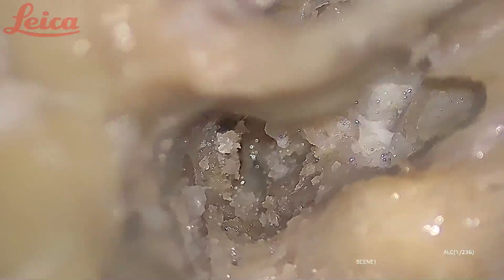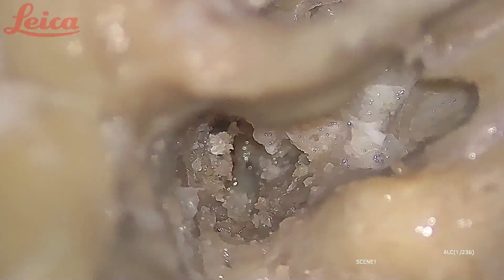What you are seeing now is the GSPN — the greater superficial petrosal nerve. I will show you the soft structure here; this is exposing the area of the GSPN, the greater superficial petrosal nerve.